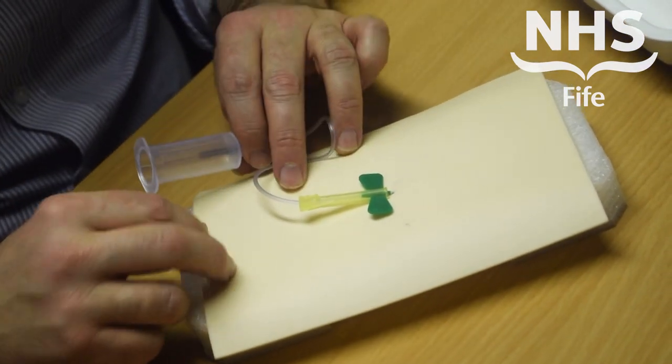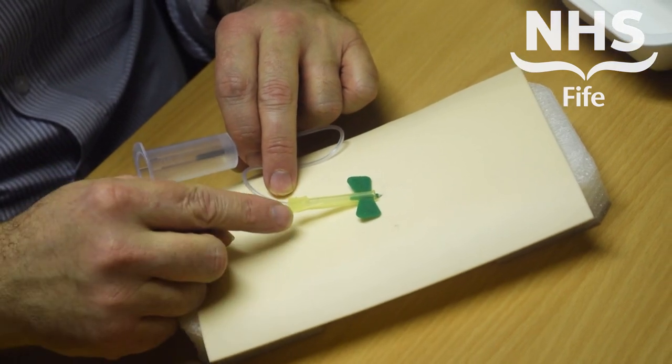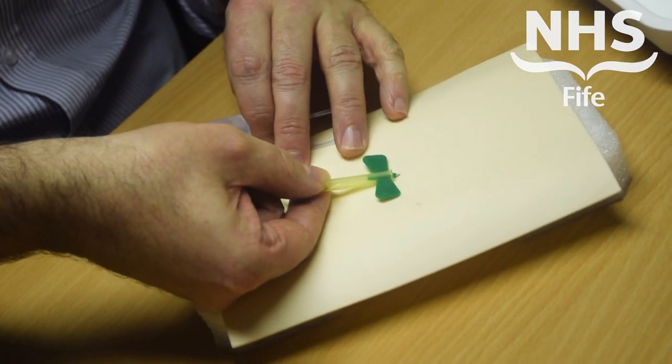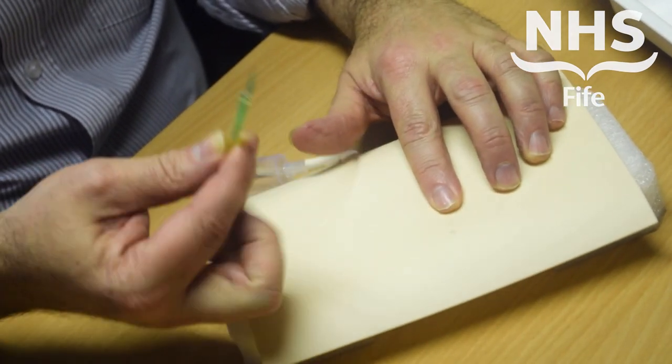When it's time to remove the device, grip it with your thumb and forefinger. You'll see there's a little thumb indentation there. You want to hold on to the yellow part of the device using your thumb with the forefinger underneath. That can be removed, and obviously you would apply pressure to the wound for the patient.